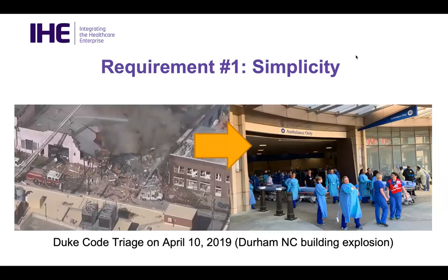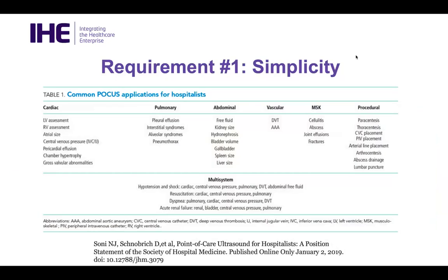So we have to have the ability to very simply put in metadata on the images, whether they be point of care ultrasound or the still images that we capture. And messing up patient A's images with patient B can have some really significant consequences. So the simplicity matters. And again, orders can get challenging in these settings.